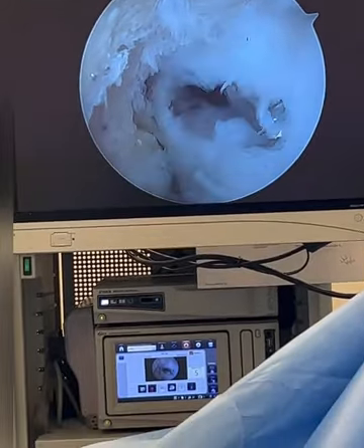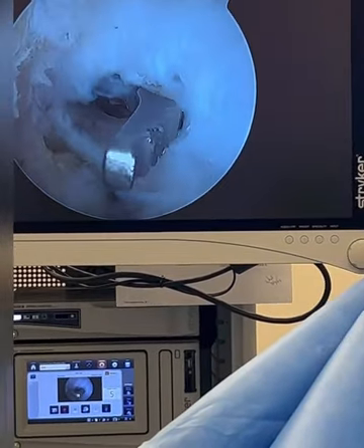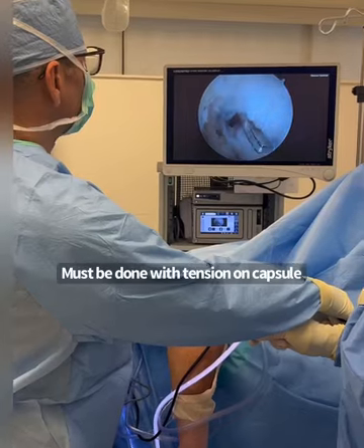Once I added a little bit more tension on the capsule I was able to do it better. I have the obturator retractor in there — this is going to help the patient to be able to extend.